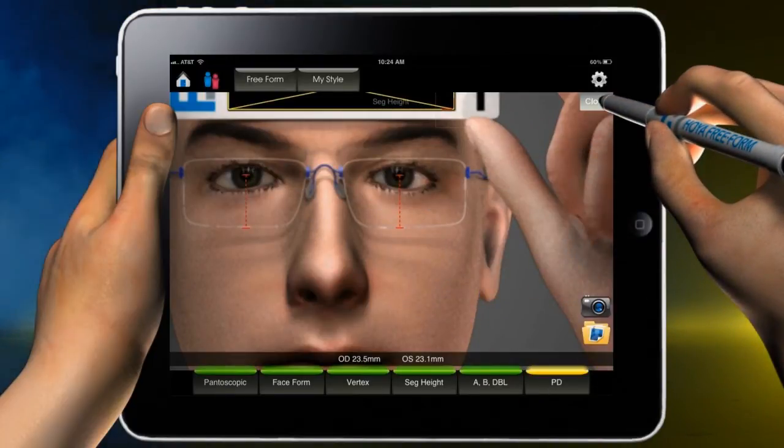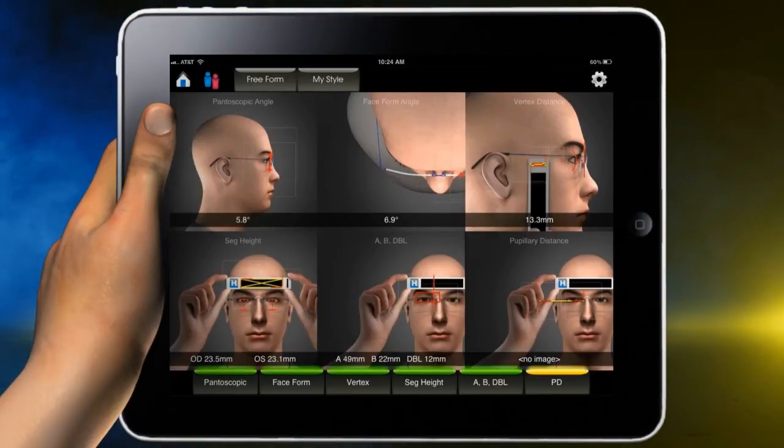When satisfied, touch the close button and move on to A, B, DBL measurements.